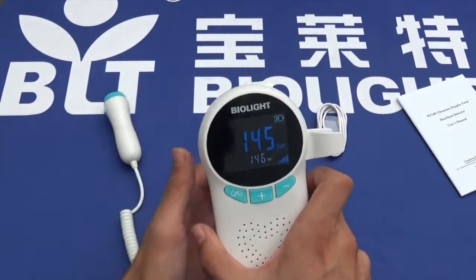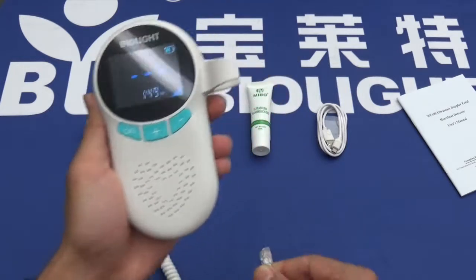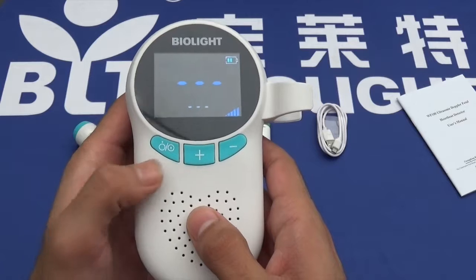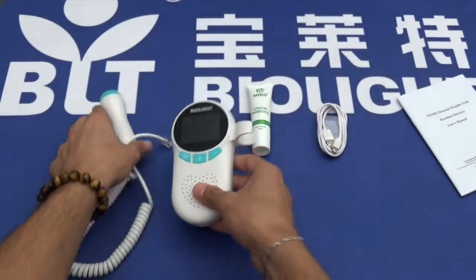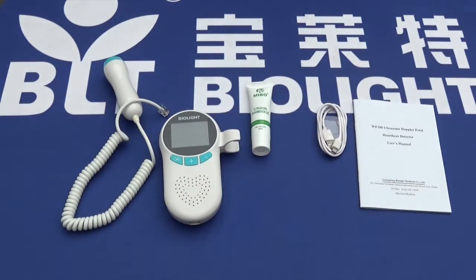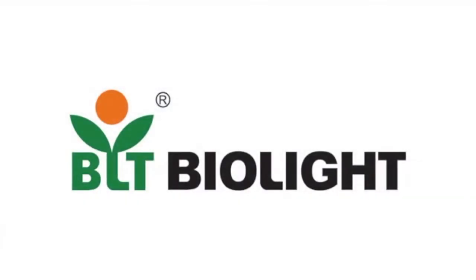To stop use of the device, simply pull out the Doppler. To turn off the device, simply press the same button. And that's everything for this product. Thank you very much for watching. If you have any further questions, please don't hesitate to contact BioLite. Thank you.